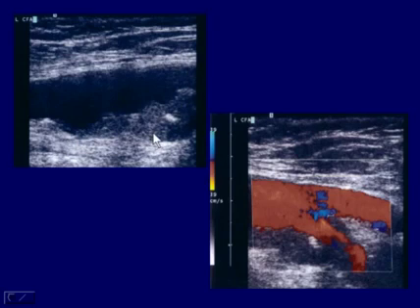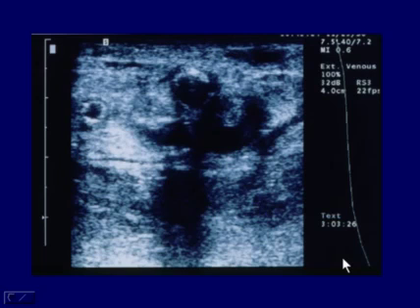And we need these type of images to define what's going on, and that information then can be used to determine what's best for those patients. In this particular patient, we can see continuing on down into the common femoral artery, we don't really see any kind of narrowing in the flow channel, good filling out. So most of this disease is really not encompassing any of the superficial femoral artery in this example, but it is filling in along the back wall here and partially obstructing the profunda femoral artery in this particular patient.